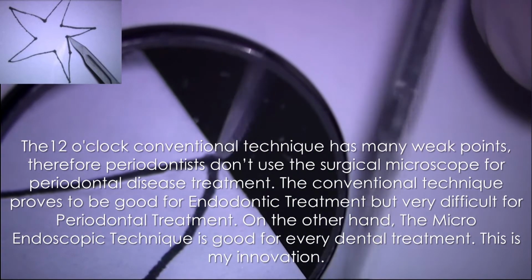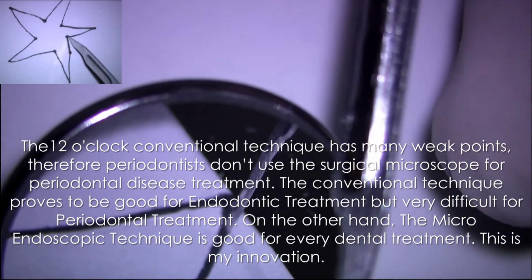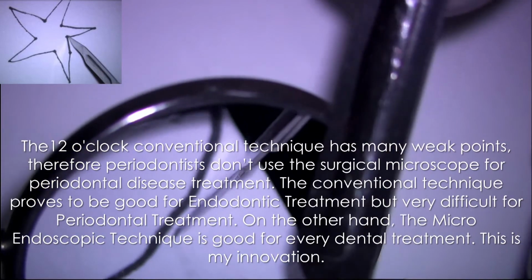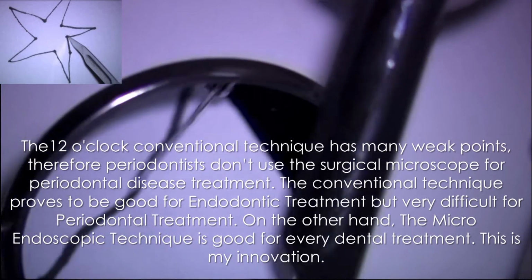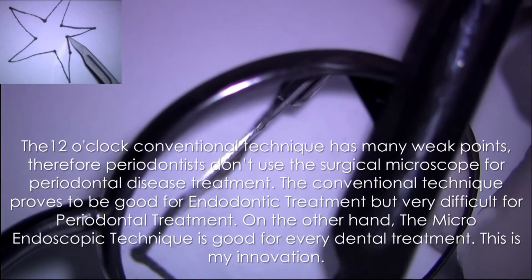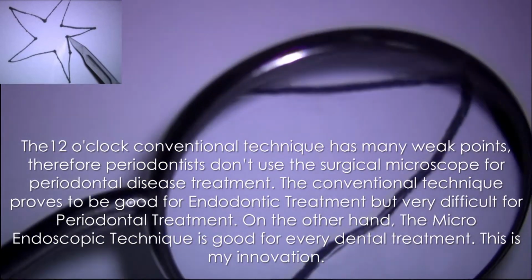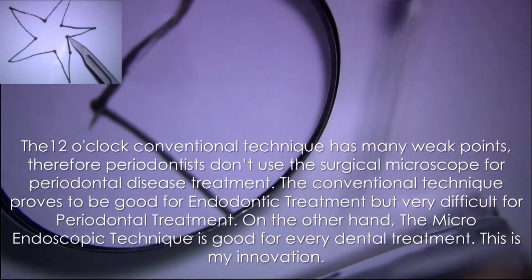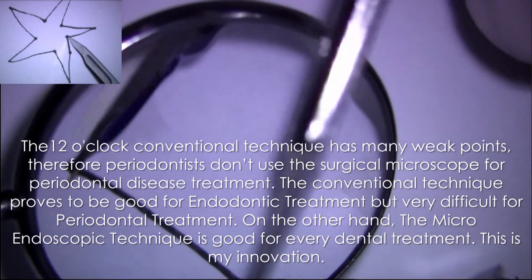The 12 o'clock conventional technique has many weak points. Therefore, periodontists don't use the surgical microscope for periodontal disease treatment. The conventional technique proves to be good for endodontic treatment but very difficult for periodontal treatment. On the other hand, the microscopic technique is good for every dental treatment. So this is my innovation.